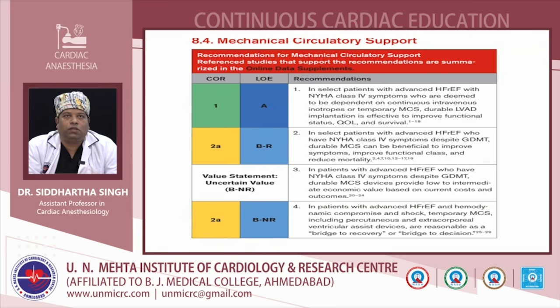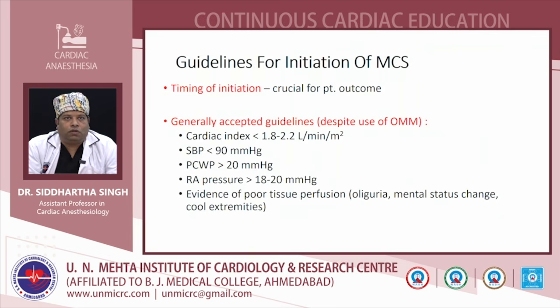The recommendation is a class 2A recommendation for mechanical circulatory support. Class 2A means mechanical circulatory support may improve the patient outcome if used. So the guideline is for initiation of mechanical circulatory support.